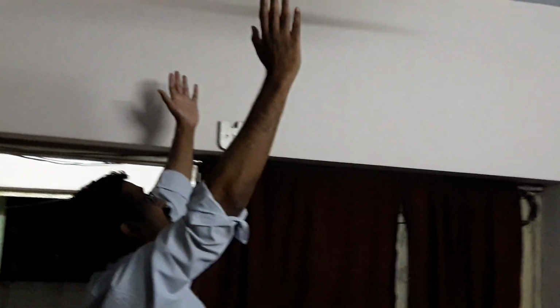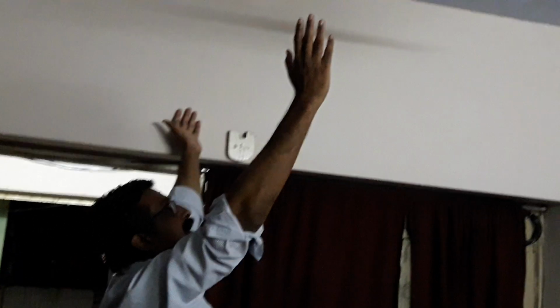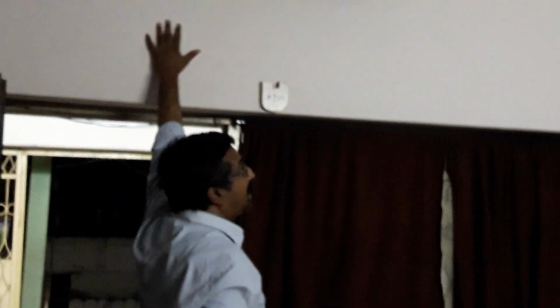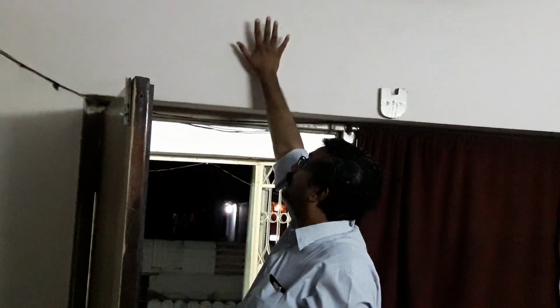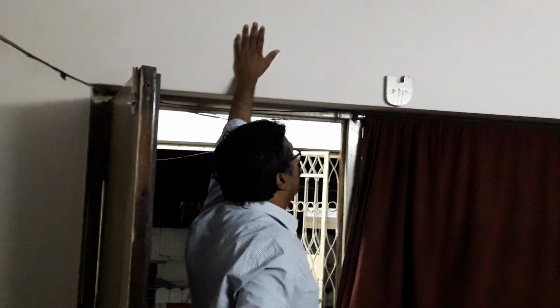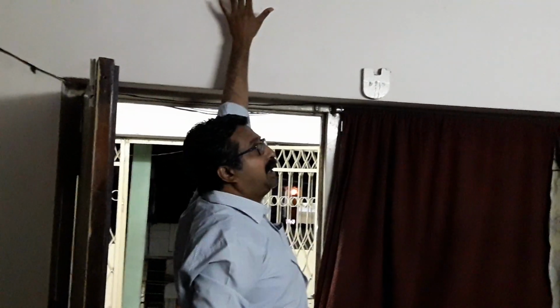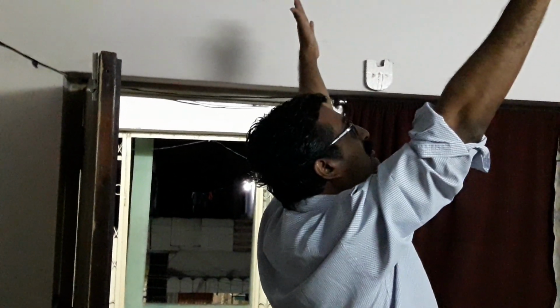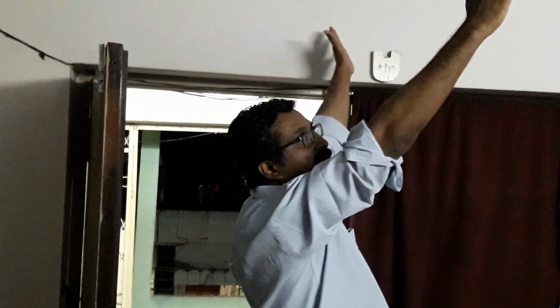Always one cell is present between the anterior wall of the bulla and the tube light. This upper part is the upper part of the anterior wall of the bulla. Even if you remove the bulla anterior wall, this superior wall attachment to the skull is still present. So always one cell is present between the upper attachment of the anterior wall of the bulla and the tube light.